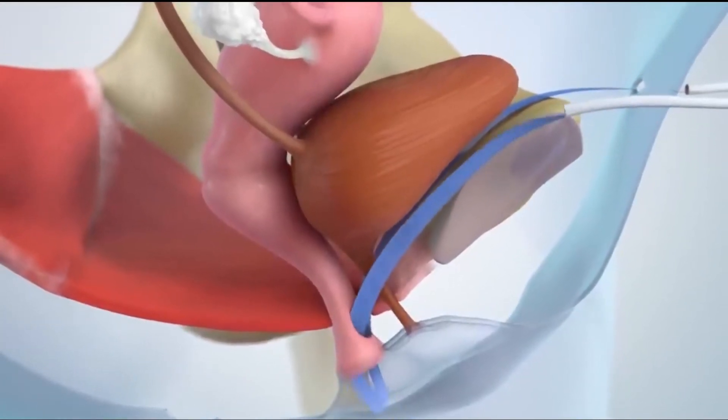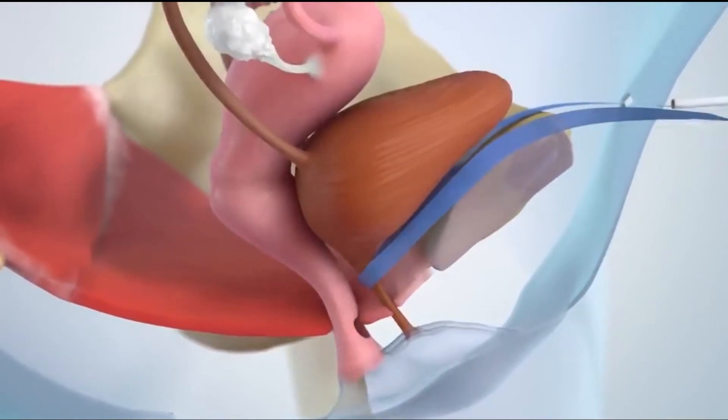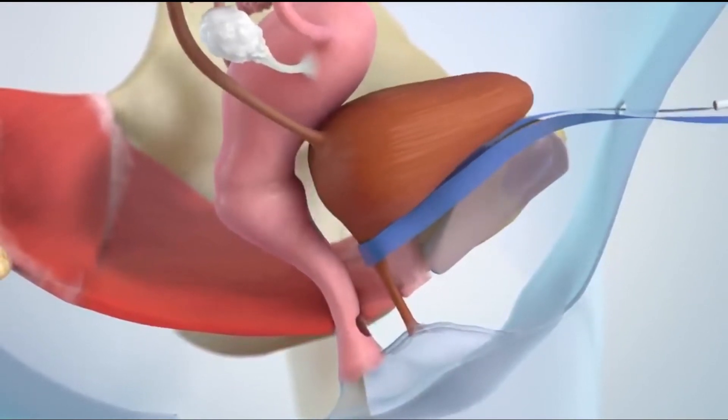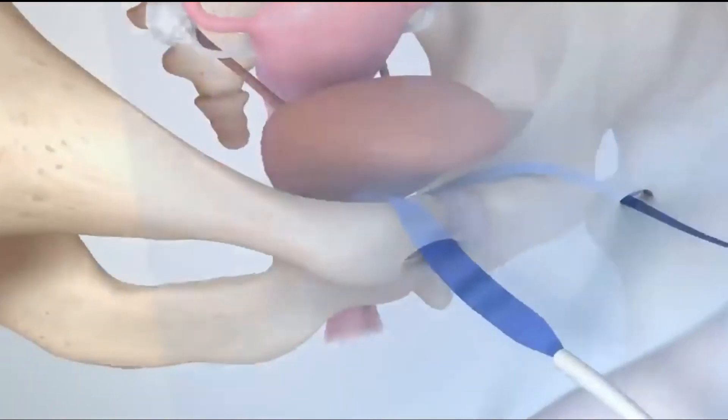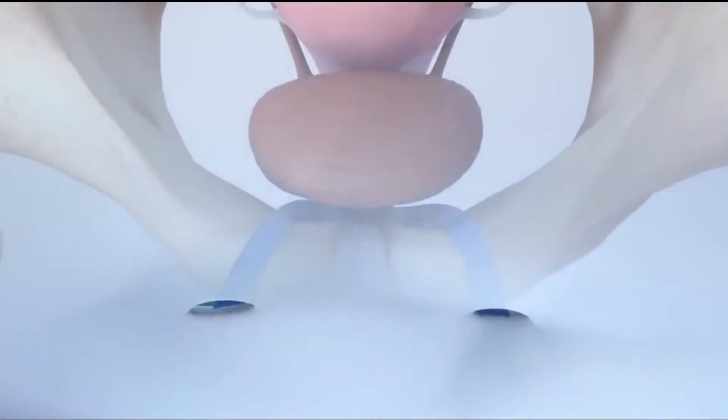Once the tape is in place, your surgeon will adjust it around your urethra to provide support. The ends of the tape will be cut just beneath your skin.